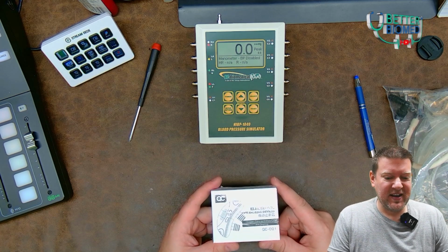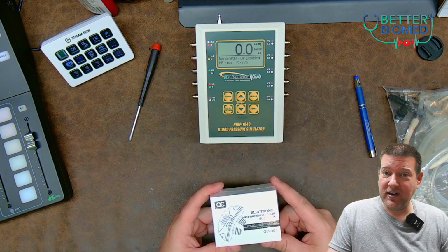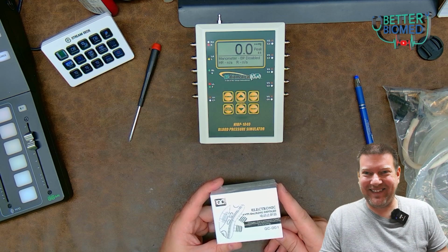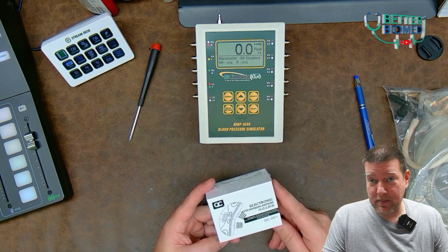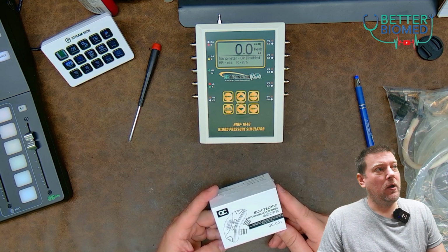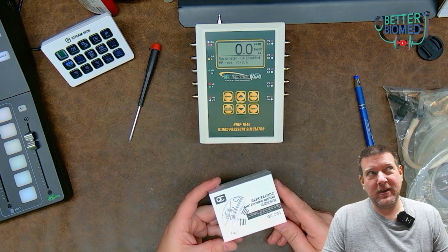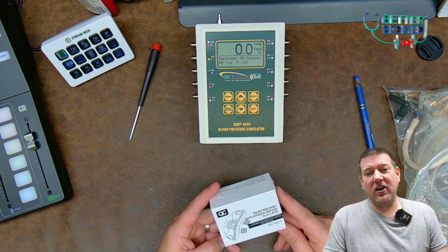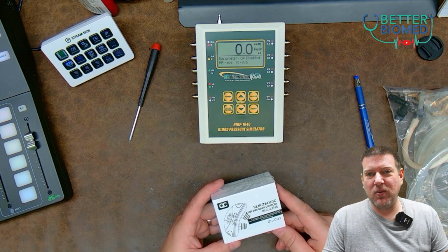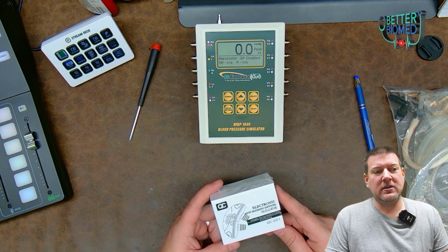What I have here is an electronic anti-snoring device. It says it's an oxygen concentrator and a CPAP. Well, we can call BS on that immediately for a couple different reasons. Oxygen concentrator. I don't care what type of fan is blowing on your face.